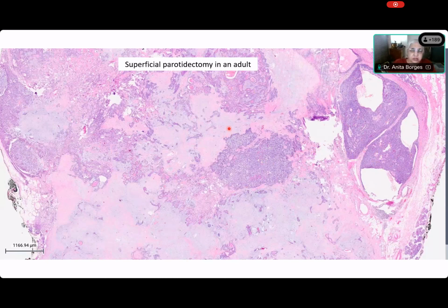Now, if you had mentioned the myxochondroid, somebody was saying something. Myxochondroid, that's what hits you right in the face. And Shivani, you didn't see the myxochondroid? Ma'am, I said myxochondroid stroma. Myxochondroid stroma. Okay. Yes, ma'am, I said it. All right, I'm sorry if I didn't hear you.